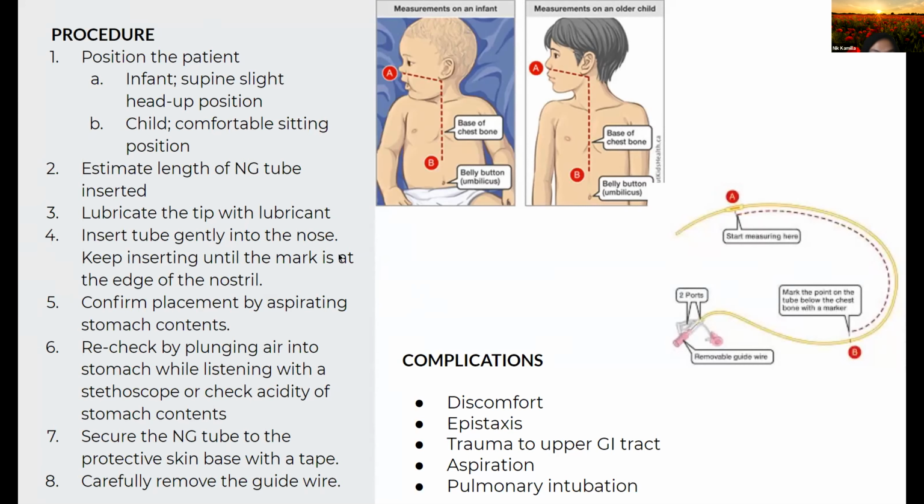And then the third step is we lubricate the tip with a water-based lubricant, and then we can start inserting the tube gently into the nose. So keep inserting until the mark that we taped earlier is at the edge of the nostril.